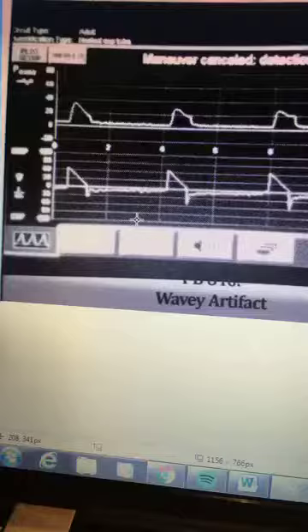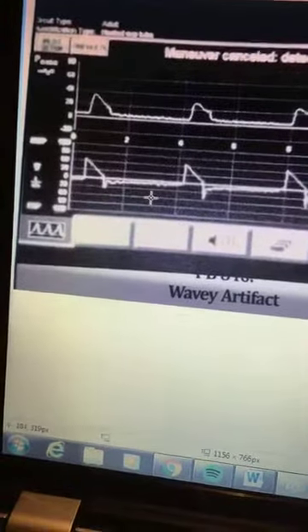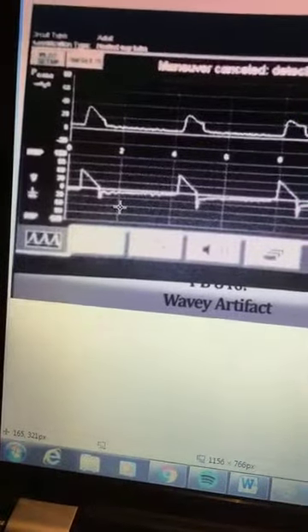One problem with heated wire circuits is water in the tubing. So when you have water in the tubing, you're going to see some of this wavy artifact on the flow by time scalar. If you look at it closely, you can tell it's real jagged there. Obviously, that can be corrected by emptying the water in the tubing and adjusting the temperature on your heated wire circuit.